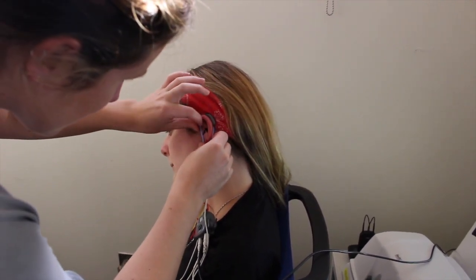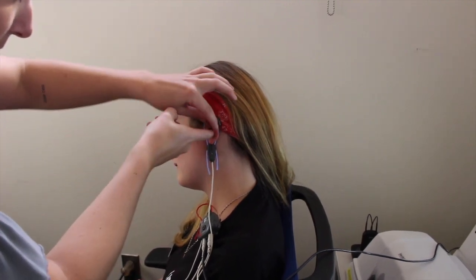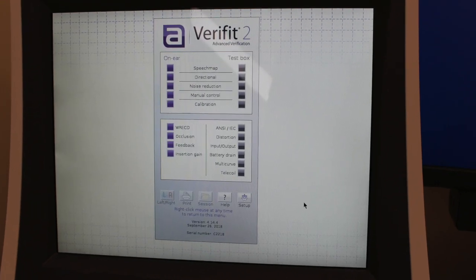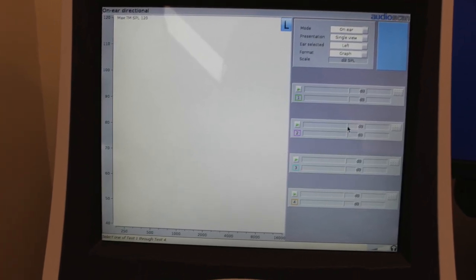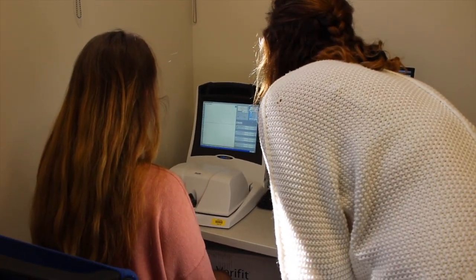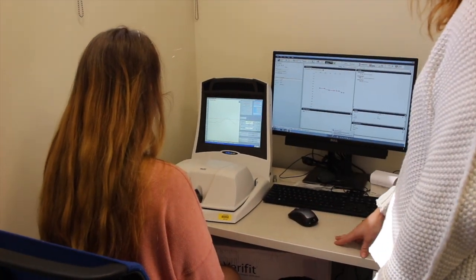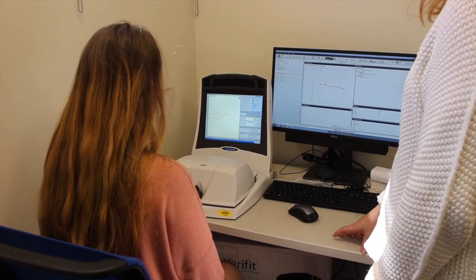One option for verifying directionality with the VeriFit is the directional on-ear option. This method requires the forward speaker on the VeriFit as well as a secondary speaker positioned behind the patient. We will be demonstrating an alternative method to test for directionality that doesn't need a secondary speaker if you do not have one available to you. With the patient facing the VeriFit speaker, run a speech map using pink noise at a level above 70 dB. In this instance, we presented the pink noise at 75 dB. Record the speech map and turn the patient around so that they are 180 degrees azimuth from the speaker.